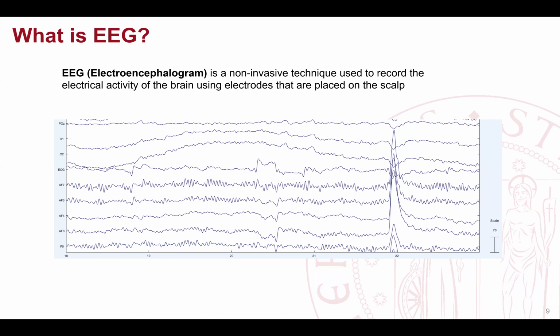So if you ever tried to record the EEG signal, normally what you end up with is something like time courses similar to this, where you can see it is quite a noisy signal, which is not that easy to identify elements in. And they also have several components, because you see there are these slow waves and high frequency oscillations. So it is a very complicated and heterogeneous signal, which can really be studied from different perspectives.